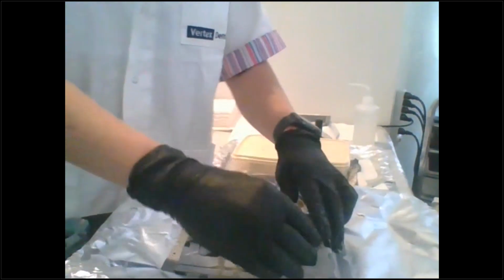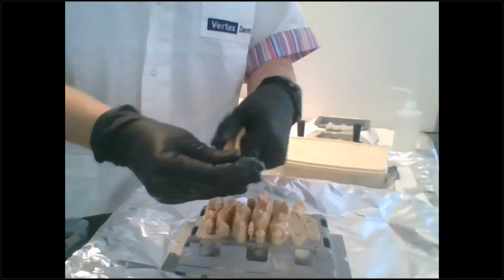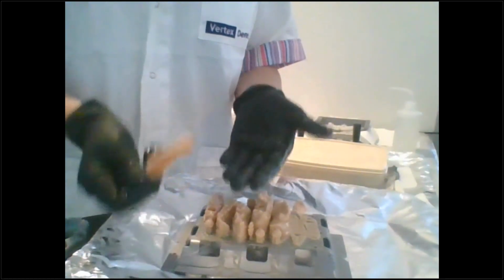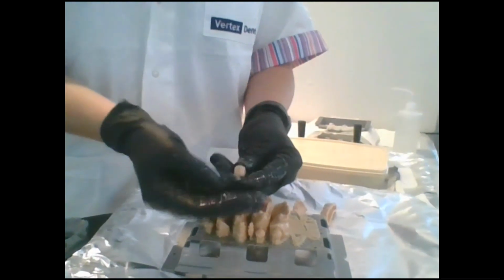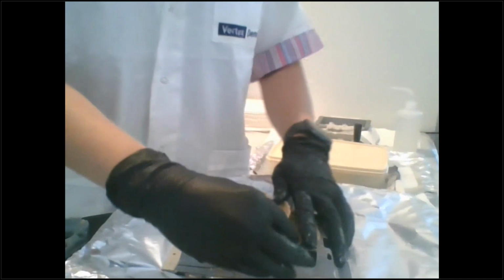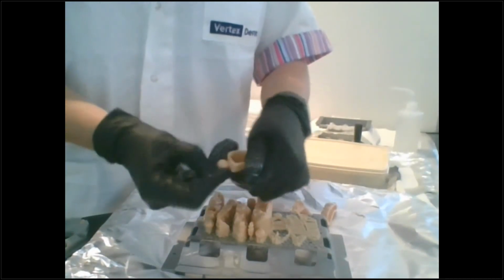The longer you let model white sit or CNB MFH sit, the harder the supports are to remove. So if you just take them off and remove them right away, don't wait until after you've cleaned them. Just take them off, rub them off. See, my dies have literally no scarring at all. Okay, and if you just give it a little twist.